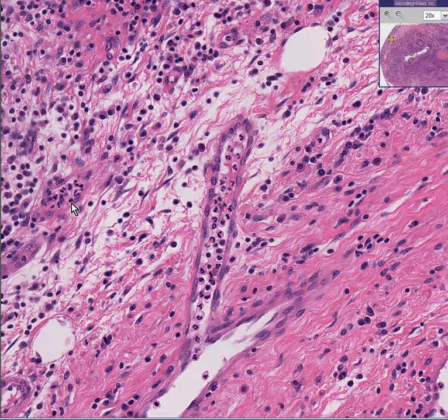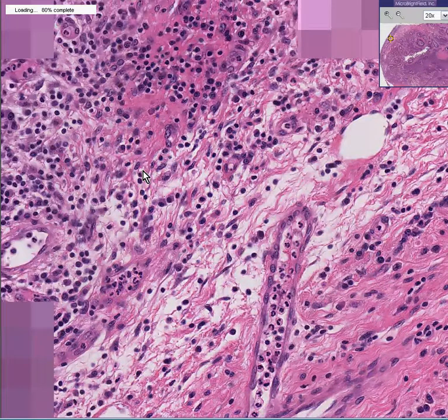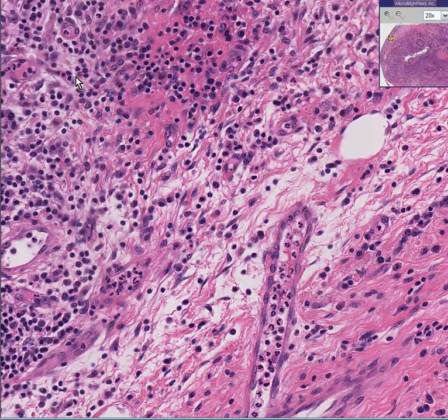So here we have, like in one view, a really good example of acute, organizing, and chronic inflammation, don't we? The lymphocytes are chronic inflammatory cells. These budding blood vessels here, here, here, and here, and here, and here is organizing inflammation. And there's still some remnant of a lot of neutrophils. Every single cell inside this blood vessel is a neutrophil. So here's your acute. The blood vessels are your organizing, and the lymphocytes are your chronic inflammation.